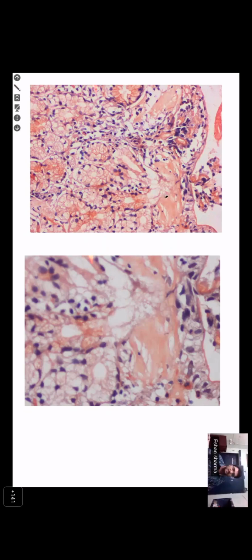Reddish pinkish, ma'am. Yeah, correct. You're right. What is that color called? Salmon pink. Okay. That's because there's a fish in the foreign countries where the flesh has that color, so they call it by the name of that. But basically it's a pinky orange color. It's not orange. Here, this is orange.